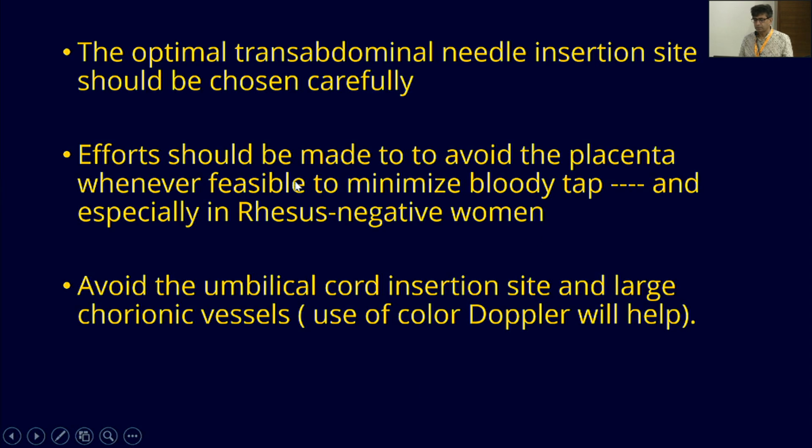A few points about amniocentesis. The optimal transabdominal needle insertion site should be chosen carefully. You have to screen properly and choose the proper site for insertion. And effort should be made to avoid the placenta whenever feasible, to minimize blood tap, and especially in Rh negative women. Though actually it's not that important a point, still it is better to avoid.